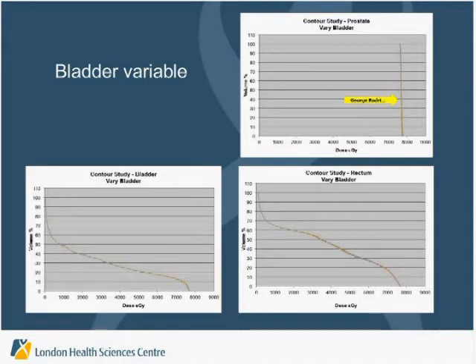And then the interesting thing is that we found that bladder had virtually little or no impact in terms of dosimetry. Which makes us believe that if you have good auto contouring technologies for bladder, maybe we don't need to be spending a lot of time editing bladders to get actually representative DVH. But then again, on the other side of things, we should be spending more time on GTV and rectum as higher priority items.